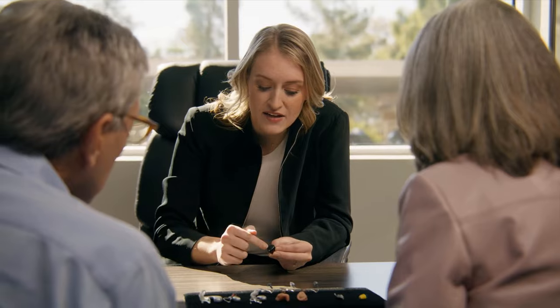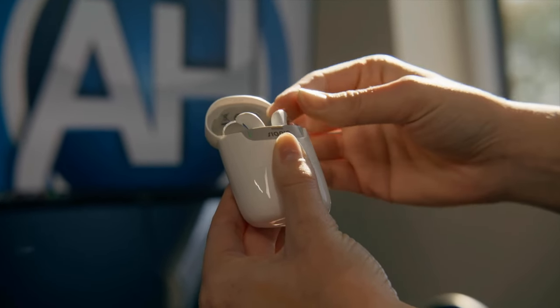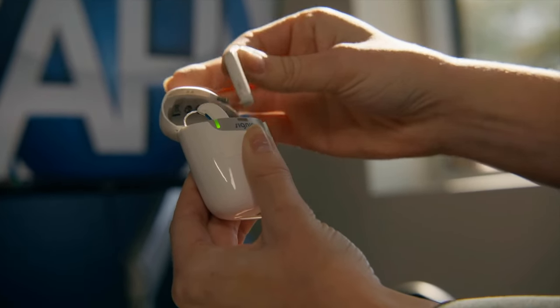The new iX platform also uses notch therapy, intended for individuals who have tinnitus. If wearing the hearing aids alone and regaining amplification doesn't reduce your perception of tinnitus, your hearing care professional can implement notch therapy. As long as they know what they're doing with it, they may be able to get your perception of tinnitus down even further.